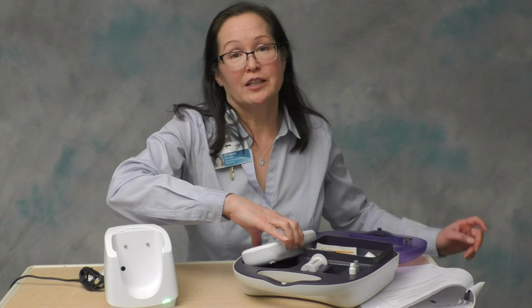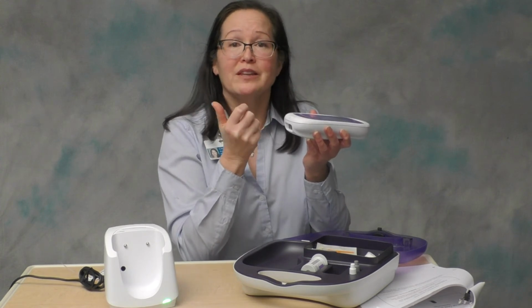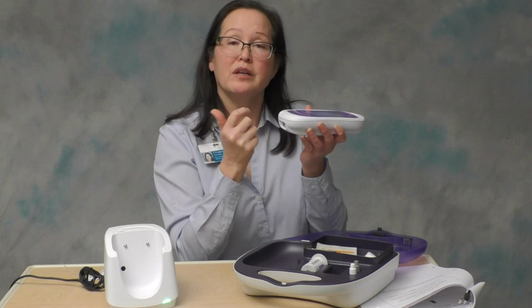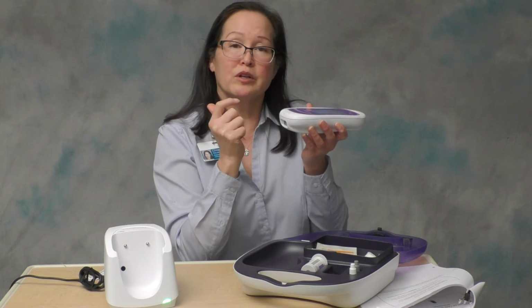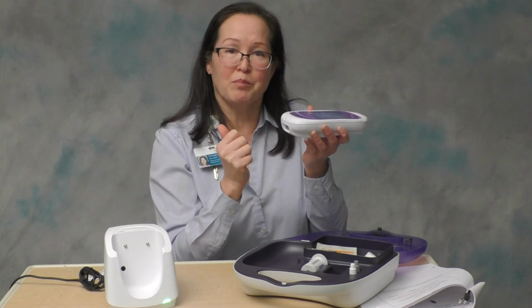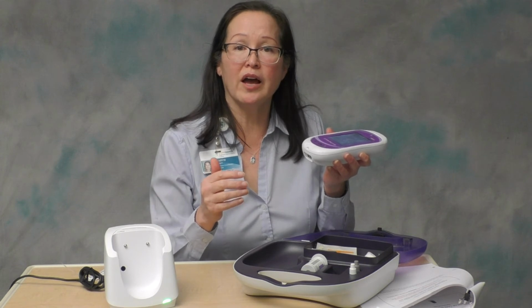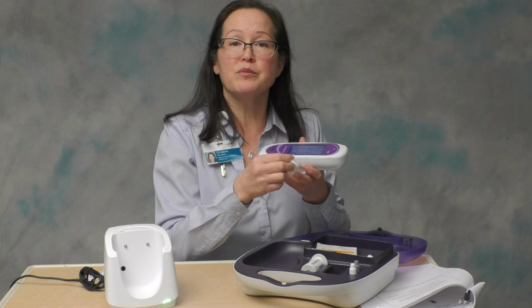With one caveat, make sure when you get that sample of blood in the syringe that you do not put your finger on the plunger. In the last month, I took 2 meters out of service because they had been dosed with line drawn samples and the blood had been squirted right straight into that test strip port. So if you get your line drawn sample, you're going to make sure, of course, that you've appropriately cleared the line, and then use a piece of gauze to expel a drop of blood from the syringe.